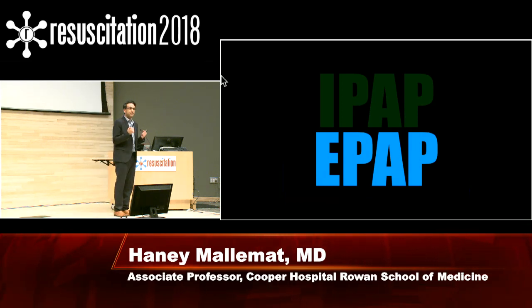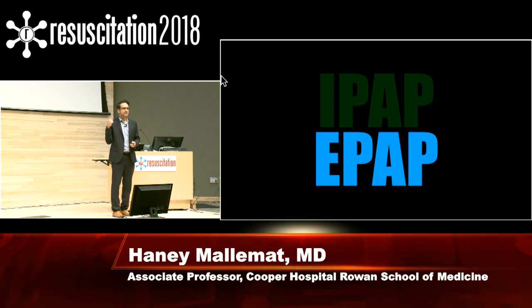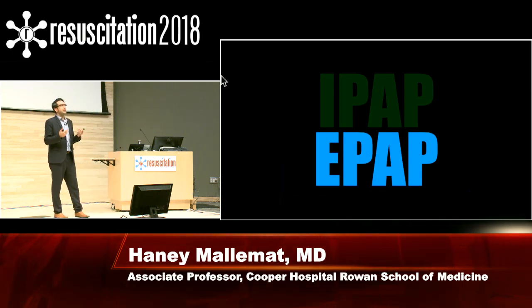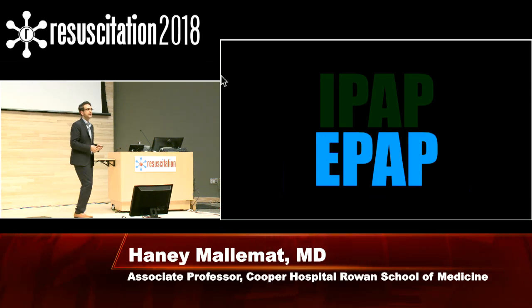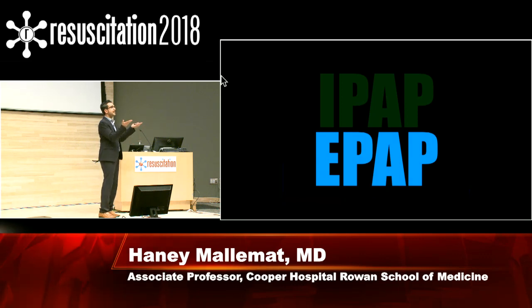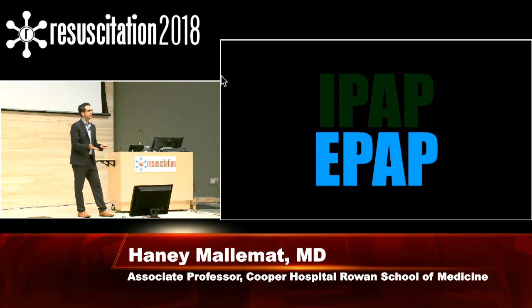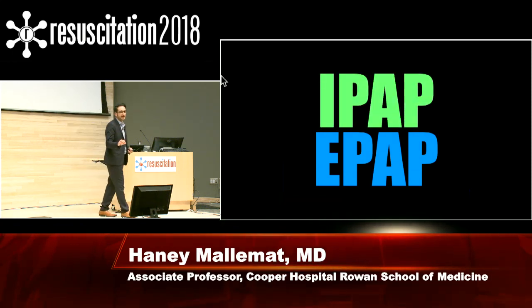So when you're doing a rep, the patient initiates that rep. And during that rep, you provide some support for them. That's what the IPAP is. You're providing support when they initiate that breath. And when it's time to release that breath, you're providing support on the way down. So IPAP is when that person initiates the breath, you provide some support in the background, and then when that's released, you provide some support on the way down. That's what BiPAP is.